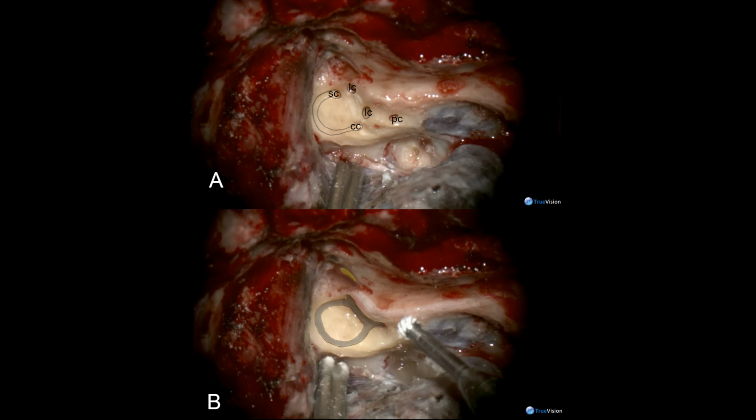Once this exposure is complete, we proceed to the labyrinthectomy. In Panel A, note the superior ampullated end of the superior semicircular canal, the crus commune on the left, and the openings of the ampullated and non-ampullated limbs of the lateral canal. Beneath the facial nerve is the single opening of the posterior canal. When viewed from beneath the horizontal facial nerve segment, the open vestibule forms a shape like a lowercase a.